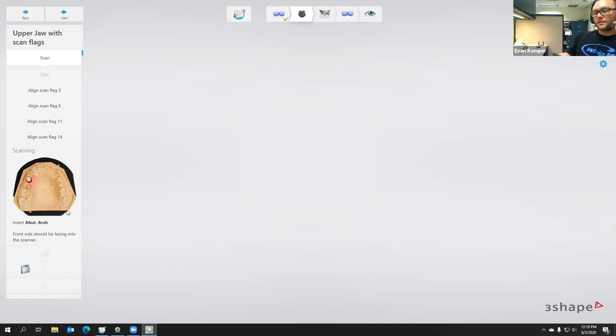Yeah. So if you can see the way this thing works, it's got first a front stop and then a slide right here that butts up against the back of your model. And then you turn this little knob right here, and that tightens it down and wedges the back. So there's no way the model moves. I'm not going to actually use it today because the multi-units are not engaging and not as likely to catch when I'm taking them out. But yeah, this is a nice little plate, and you can use it on non-implant cases too. If you are having issues with maybe a heavy model staying on the blue tack, you can just clamp them with this.